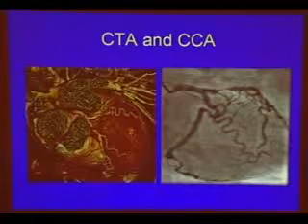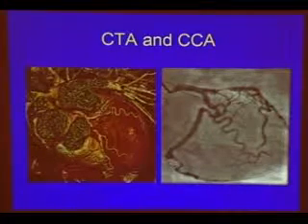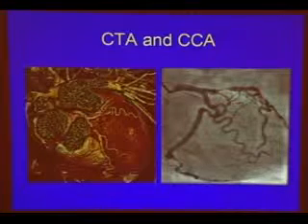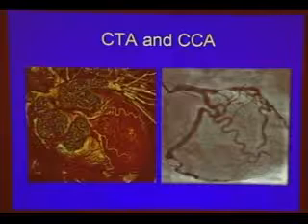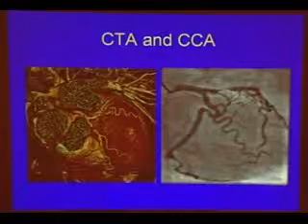However, I will say that we do have software that helps improve images that do show what we call a step-ladder artifact. We have software to improve those images in case we run into the situation.